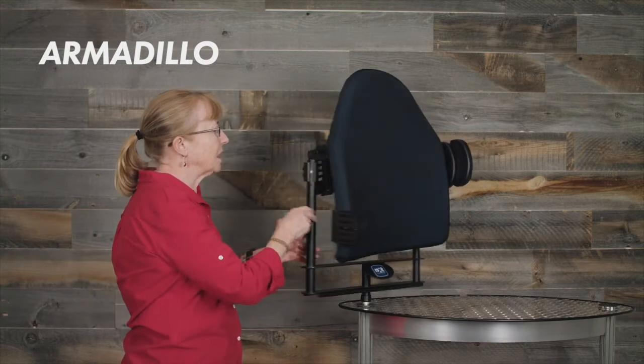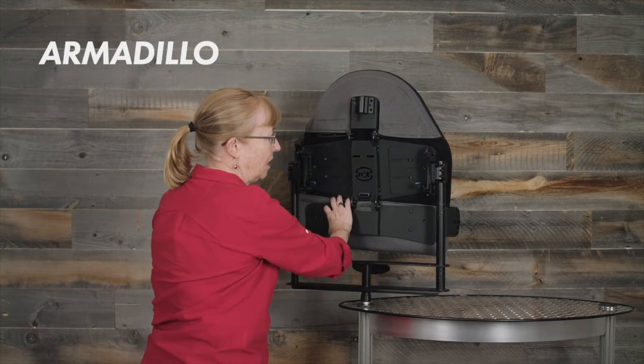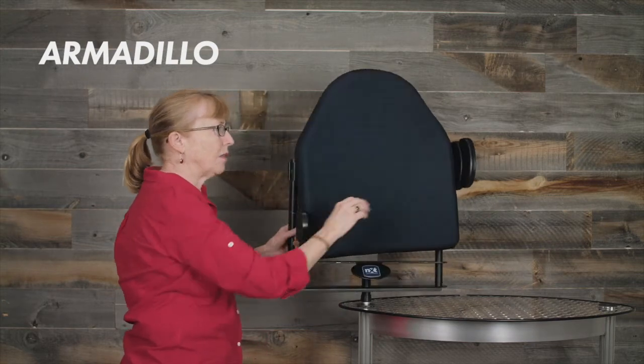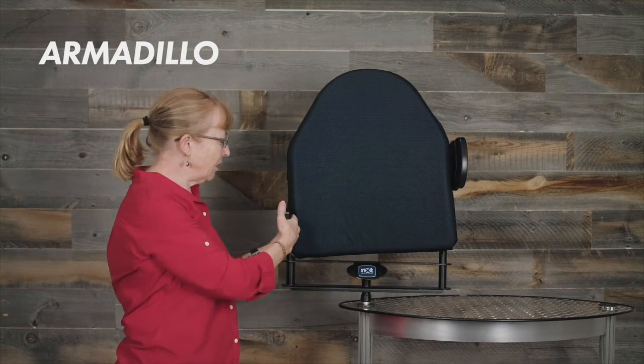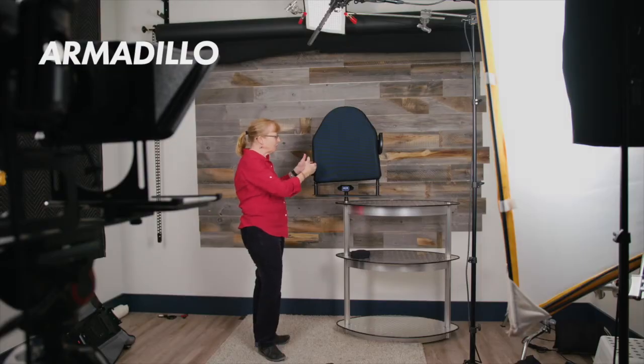We also have external lateral supports for the Armadillo, and these help with trunk support or pelvic support. They can be attached on the middle area or on the pelvic area. We have a dual pad in the thoracic area and a pelvic pad here — this is a small and that's the dual. Both of them you can push in a little more proximally or distally, as well as in and out, so there is a little flexibility for your clients.